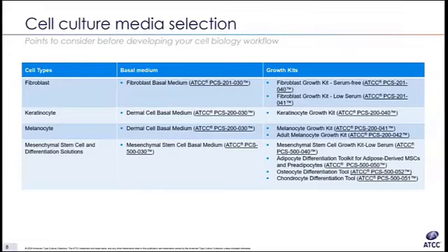Keratinocytes are the most common type of skin cell. They make up the majority of the epidermis, and they produce keratin. Most keratinocytes in primary cell culture have been isolated from the epidermis of human juvenile foreskin or adult skin. Keratinocytes cultured in serum-free, low-calcium growth medium will maintain the cells in an undifferentiated, proliferative state while inhibiting fibroblast outgrowth.